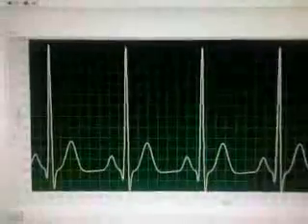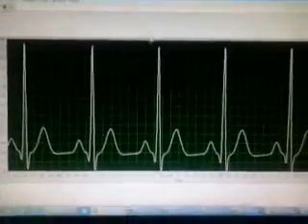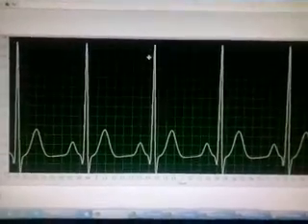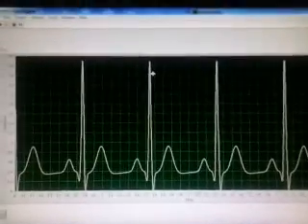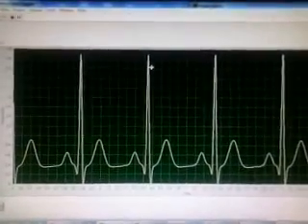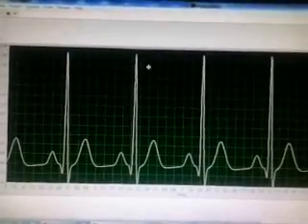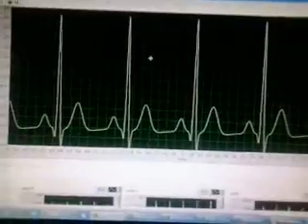Coming to the front panel of the block diagram, this front panel is for the server part. We run the server part first and then the client part for the transfer of data. This is your simulated ECG signal that is obtained using the simulator of the ECG that is inbuilt in the LabView. Here in this project we use two basic toolkits, that is one is biomedical toolkit and the other is advanced signal processing toolkit of the LabView.